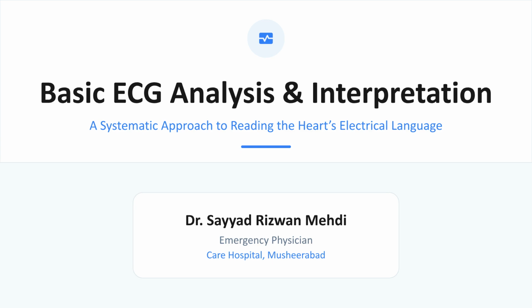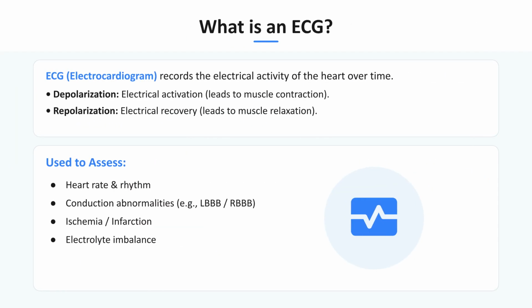Welcome to this video on basic ECG analysis and interpretation. We will cover a systematic approach to reading the heart's electrical language. What exactly is an ECG?